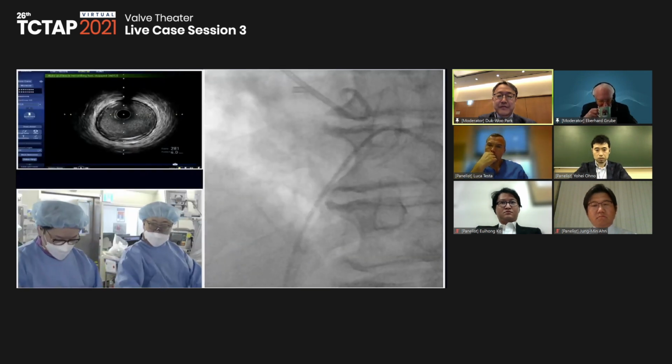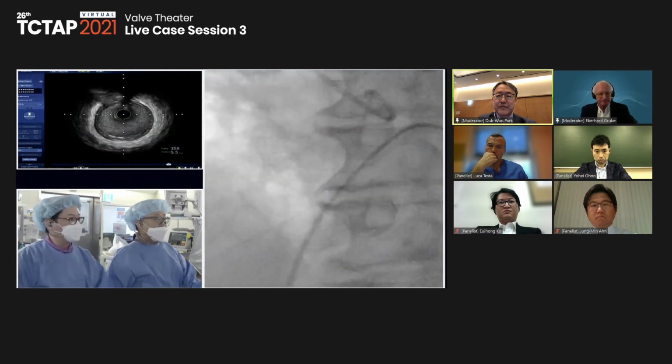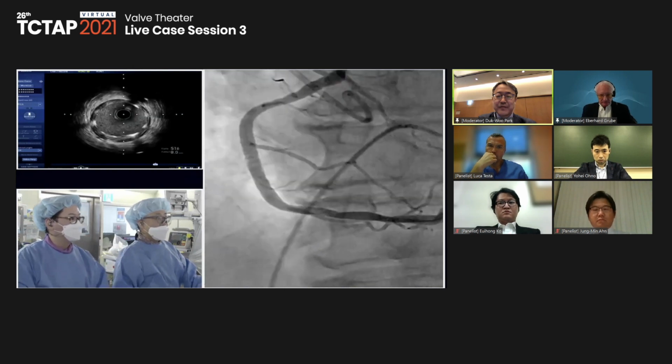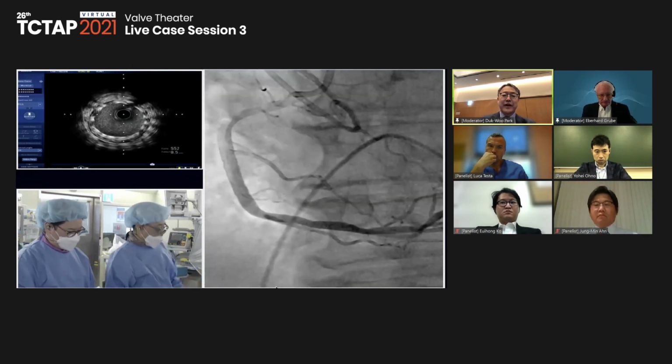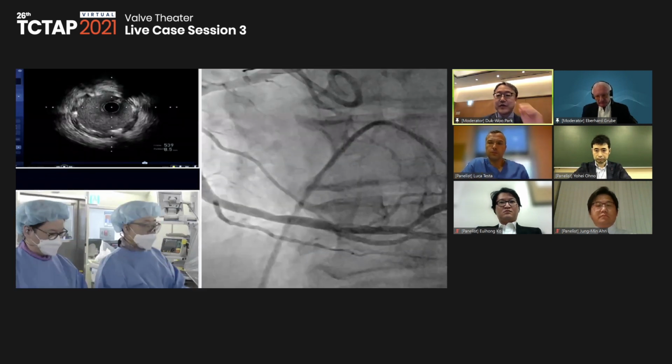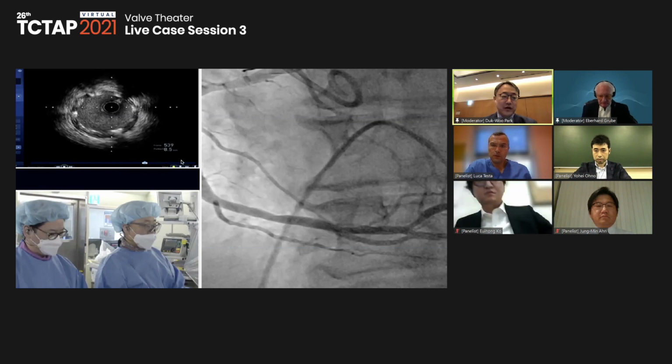We check the final coronary angiography over here. Ready? Okay, angio ready. Okay, great. So we will have the discussion time at this point, and we present this patient's background, history, as well as the current status. We will introduce the pattern of the TAVR, the step. Any question or comment? Eberhard, could you introduce?